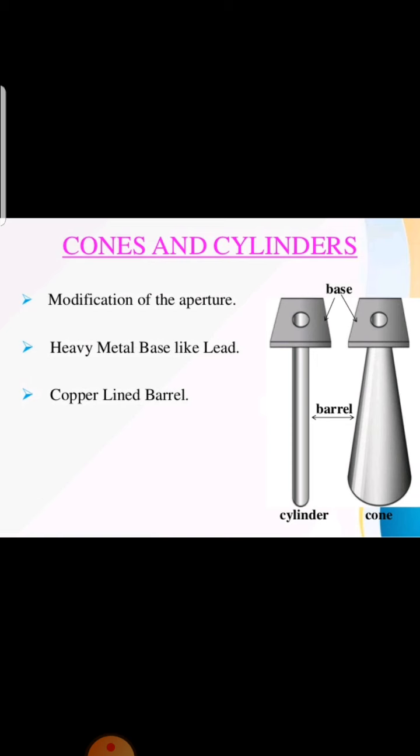We do not use the cones extensively in diagnostic radiology nowadays, and we use them nowadays for head and spine radiography.